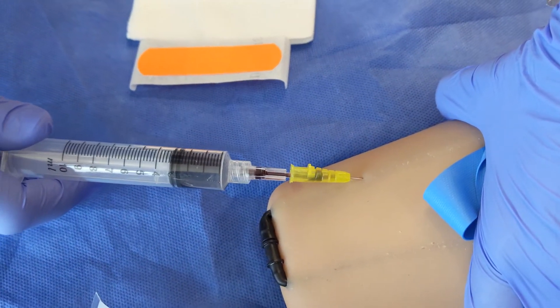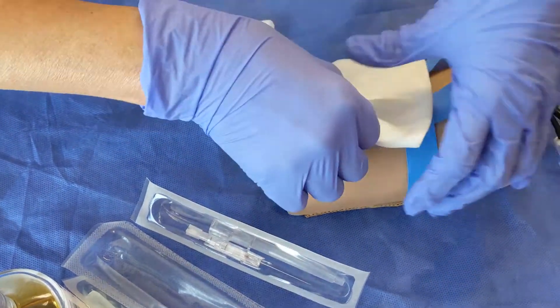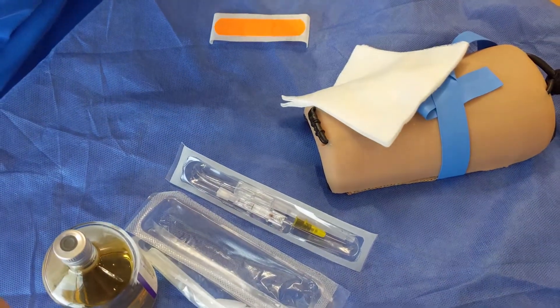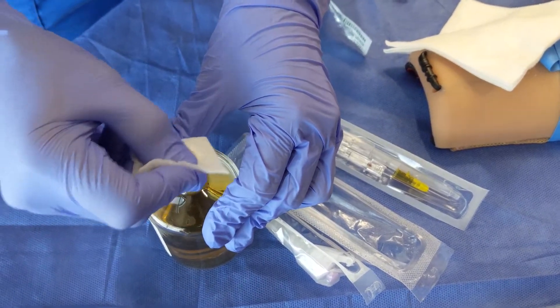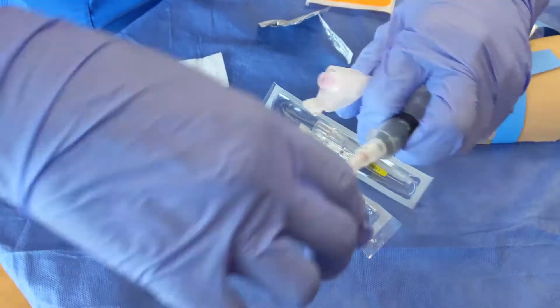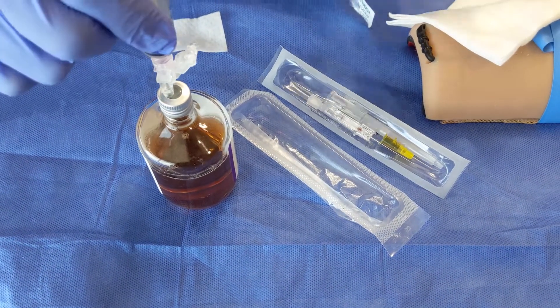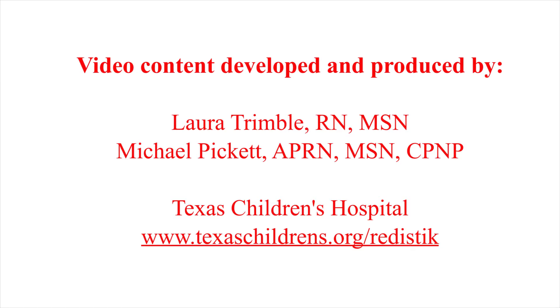We're going to say that this is all the blood that we need. So I'm going to cap that. I'm going to take out my catheter. I'll prep my culture bottle, wiping 15, waiting 15. We'll simulate that. Change my needle because the blunt cannulas don't work in culture bottles. And there we have it.